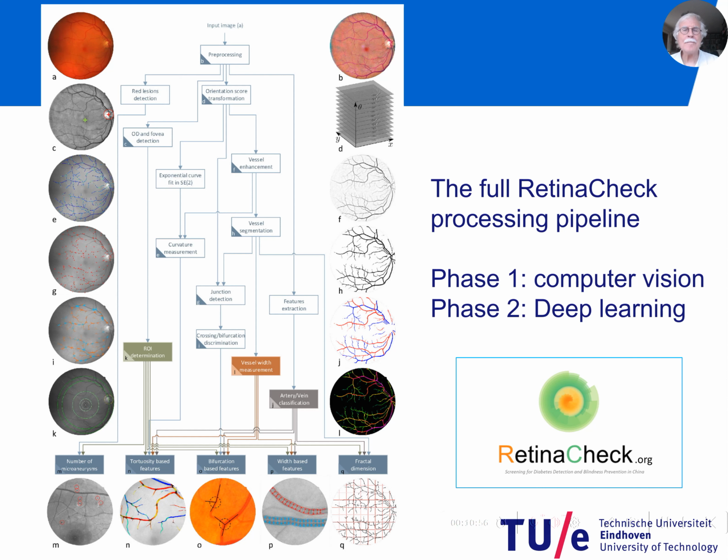You see the pipeline. It's quite detailed. In the upper left, you see the image coming in, and then we do a lot of phases step by step to extract vessels and do all kinds of analysis, and I will take you through these steps.